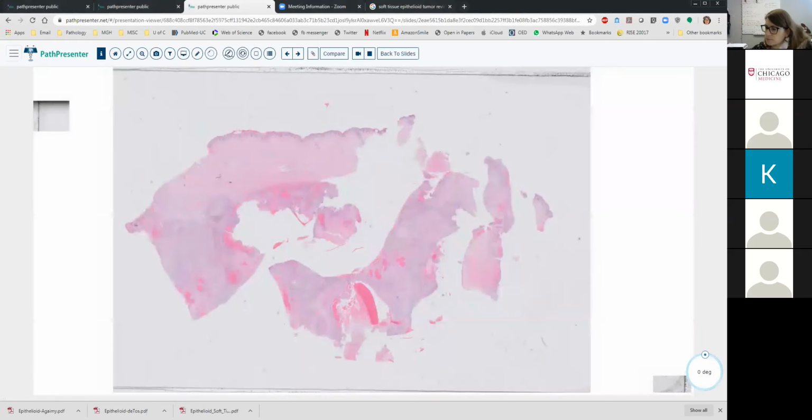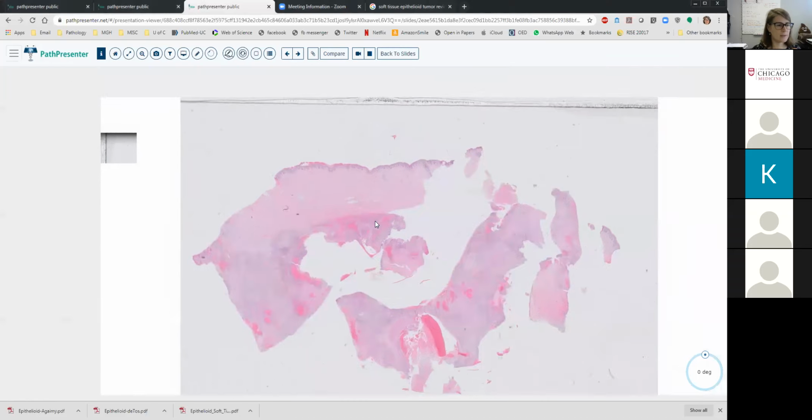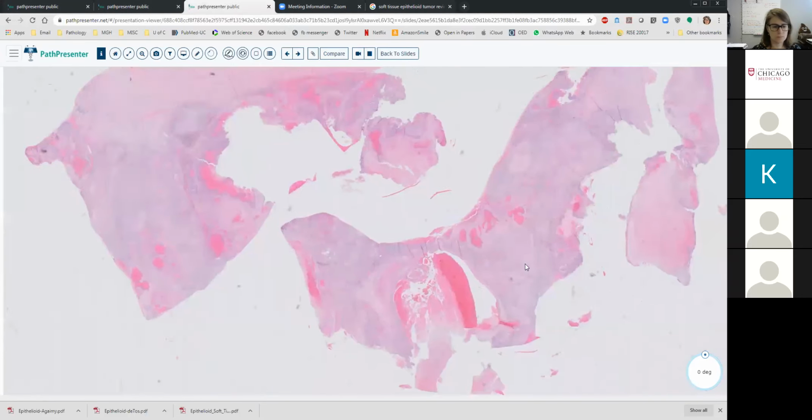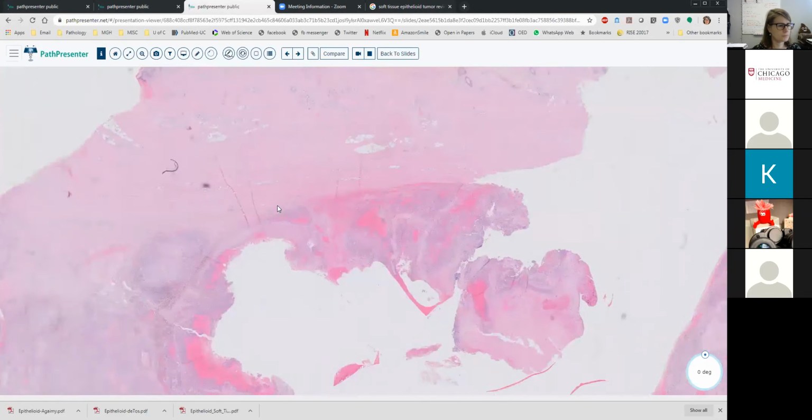Questions? Right, so GATA3, of course, would be negative, ER and PR would be negative, E-cadherin should be negative. Okay. Who wants to describe the next one? I mean, I can try. Yeah.